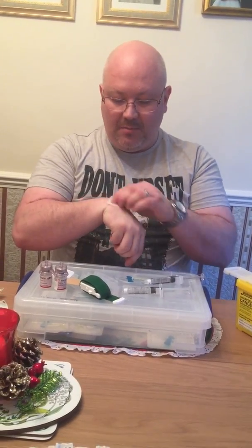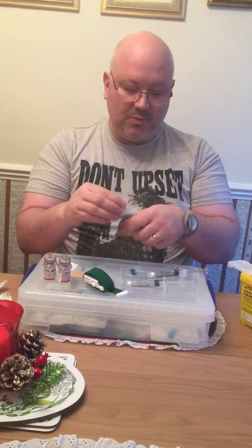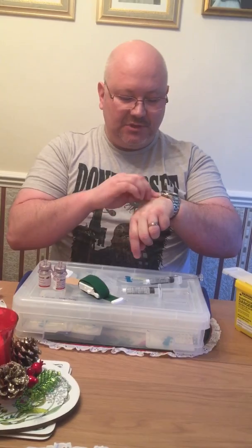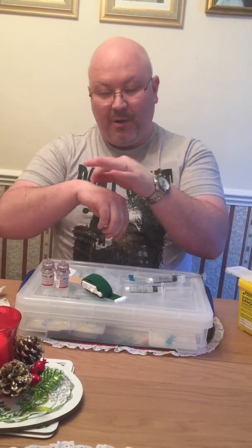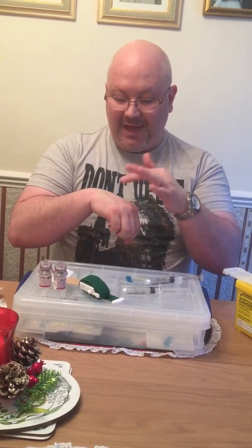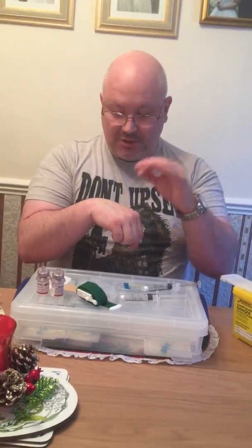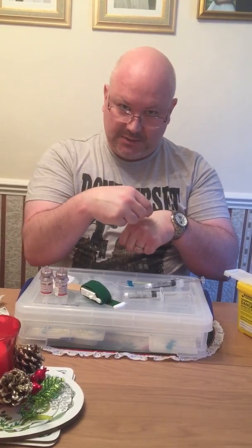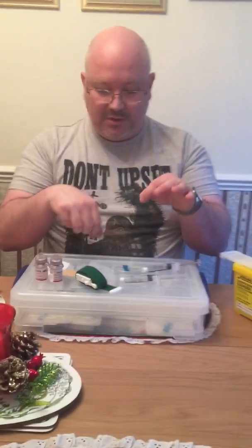Just get the swab and quickly brush over the vein. I always do my other hand as well, and there's a good reason for that — sometimes I miss the vein or sometimes I pop through the vein. If that happens, I can't use that vein again in the next few minutes. I've got to stop the bleeding there and then switch hands with a new needle. So I've done both my hands.